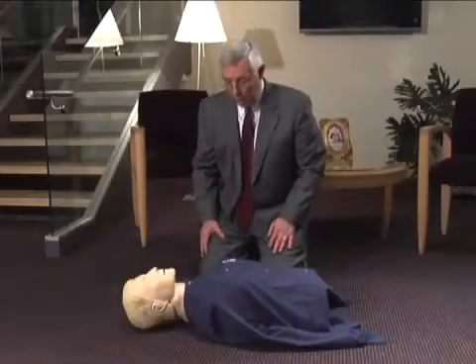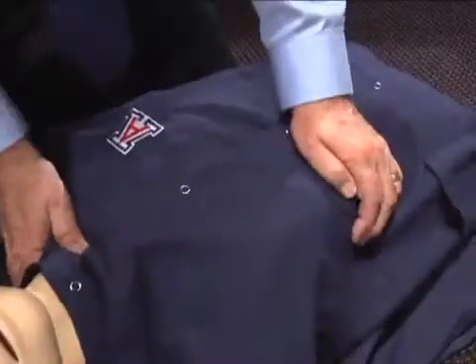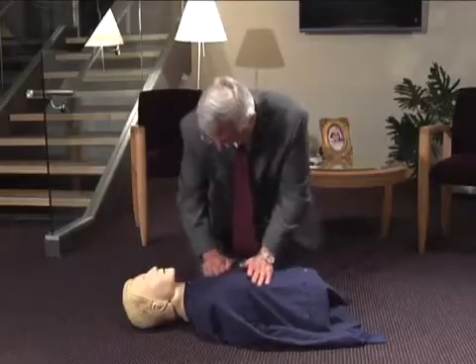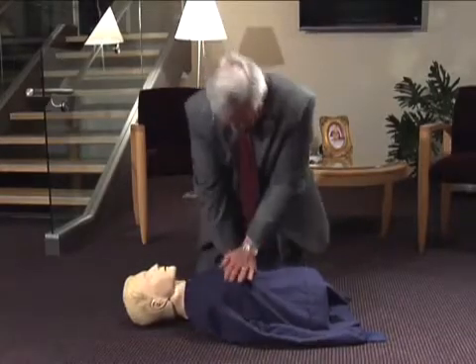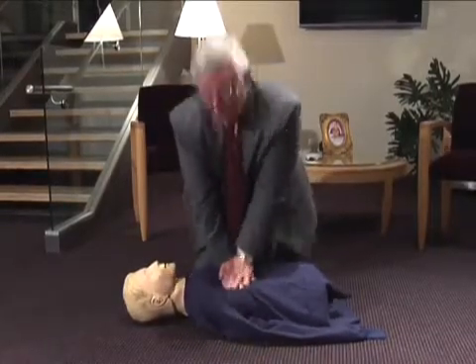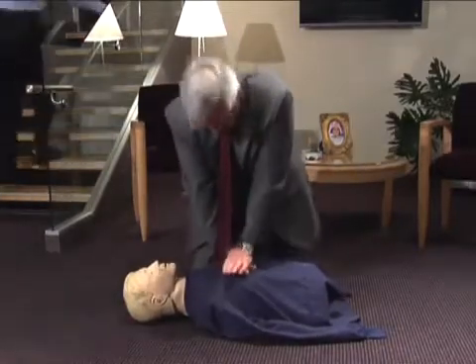First, shout and/or forcibly rub the person's chest bone hard with your knuckles to determine if the person is unresponsive. Command someone to call 911. Call 911! Or make the call yourself. Then, if an AED is available, hey, there's an AED upstairs. Go get it. Tell someone to get the AED while you begin continuous chest compression CPR.